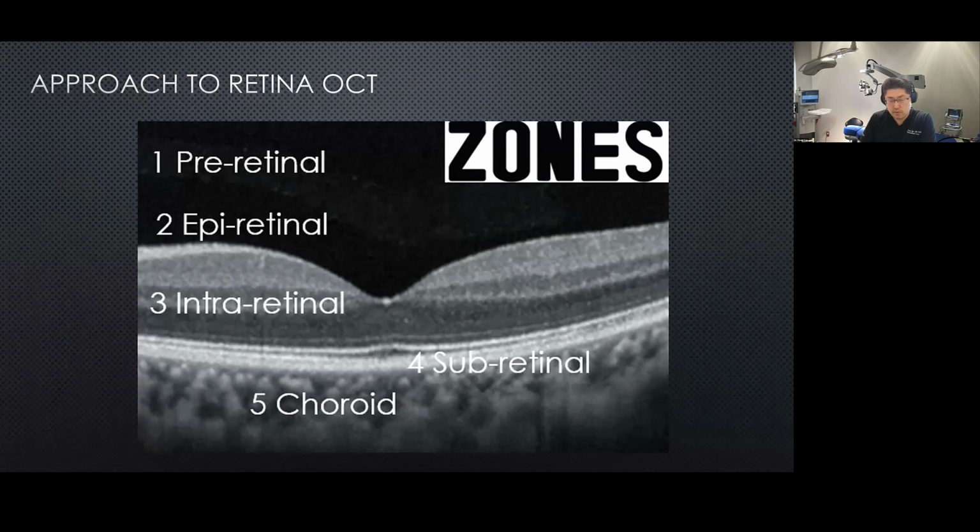And also, it's very fun to have these images and be able to tell the subtle differences of the findings on OCT. And of course, many people ask, what else do you use in retina? In addition to OCT angiography, we have Optos, autofluorescence, IVFA, ICG, and B-scan. And so it's really a great time that we have access to all these imaging modalities that help us to make the diagnosis of different conditions.